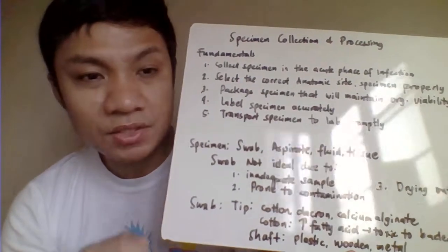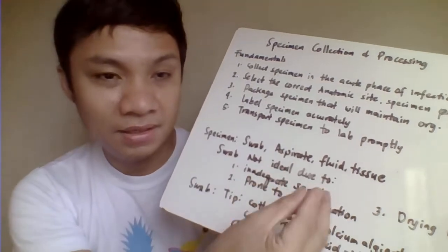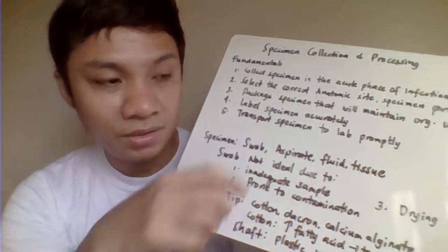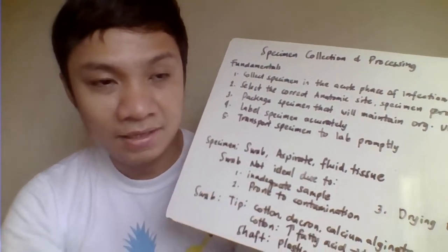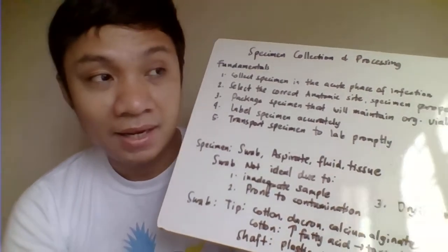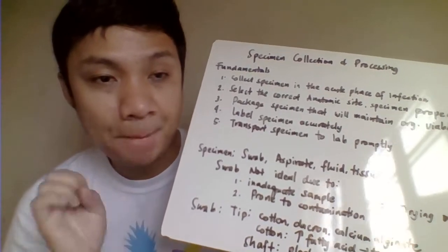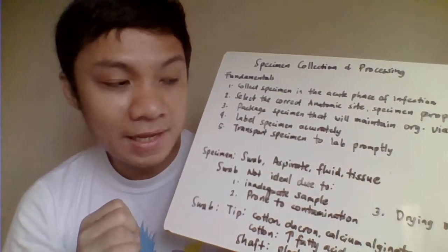The best way is your aspiration. Pag inaspirate natin ang specimen, you are collecting directly to the area where there's the microorganisms or the pathogen. Your swab, however, is still applicable. So saan ginagamit ang swab?